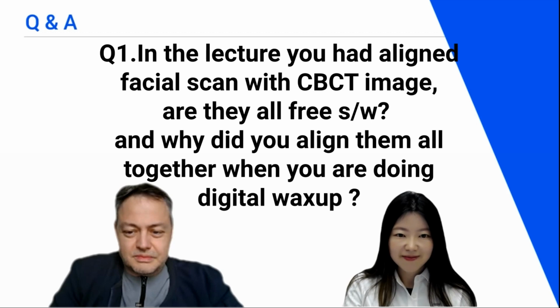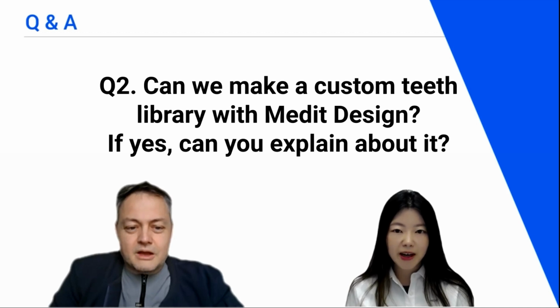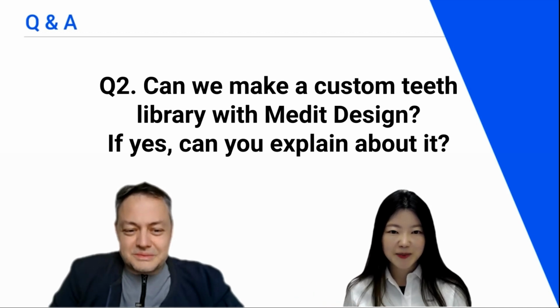Okay, so let's move on to question number 2. Question number 2, can we make a custom teeth library with Medit Design? If yes, can you explain the whole process about it?